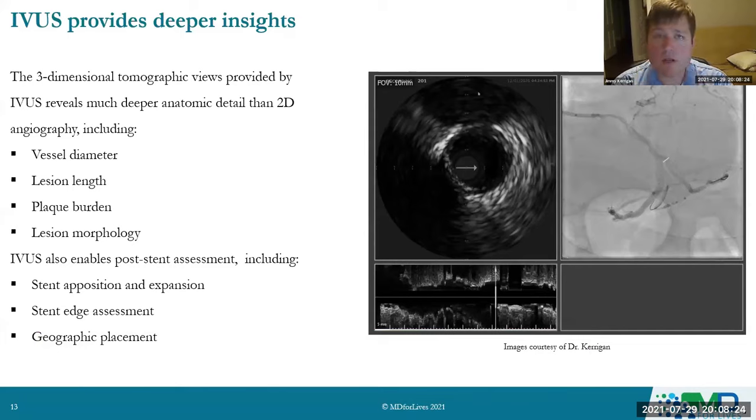Is in your interventions, or if you're a cardiologist or a non-interventionalist who is in a group who knows this, in what percentage of the interventions that you are performing or your partners are performing do you use intravascular imaging before stent implantation and after stent implantation? This is completely anonymous. There is no judgment being passed. I'm not 100% of the time either.